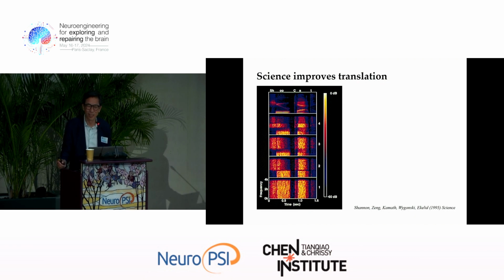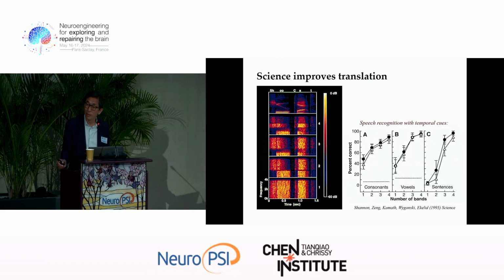That didn't work. The implant performance wasn't that great. And what surprised us, just say, how much spectral information do you need to understand speech? Well, the answer is not a whole lot. Three channels, maybe four, you can understand speech. Look at the sentence recognition on the right. Percent correct, 100%, as a function of the number of channels: 1, 2, 3, 4. Just look at 3 and 4 and compare with the original spectrogram. There's no spectral detail whatsoever, but still, we can understand. This is in quiet, 100% speech. So that really changed how we not only understand speech, but the design of a cochlear implant.